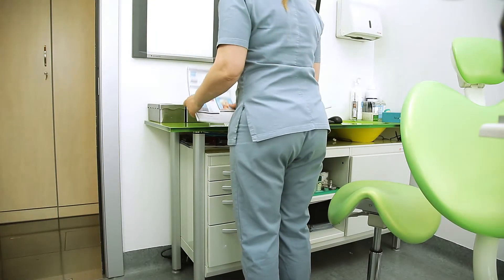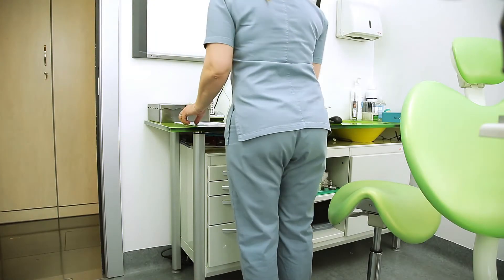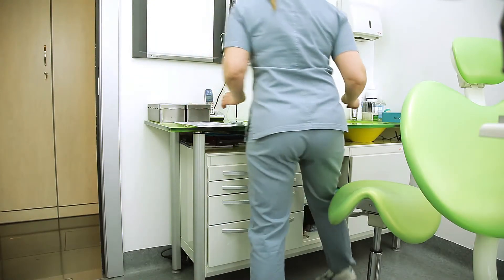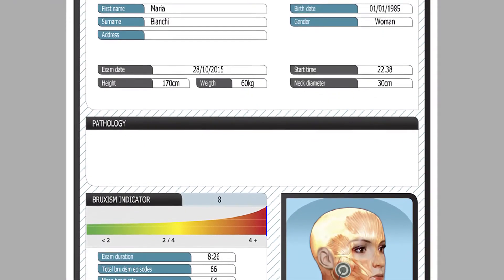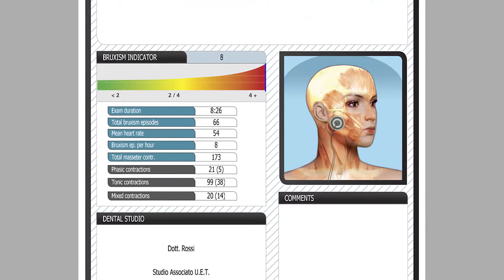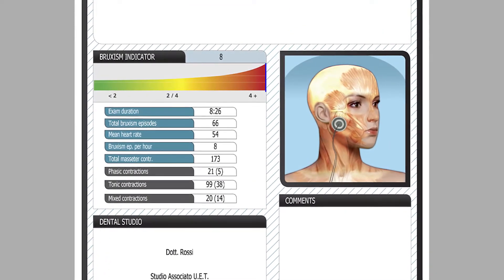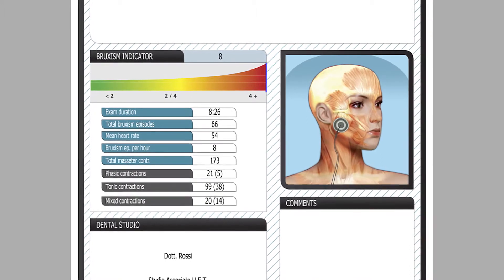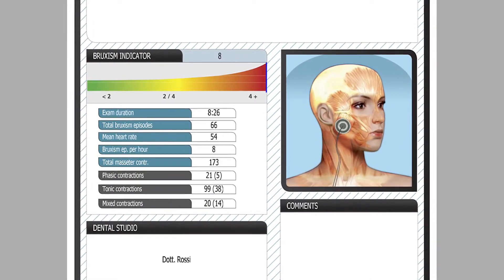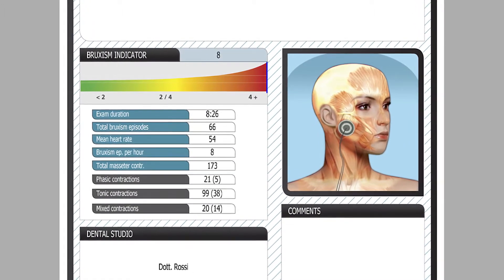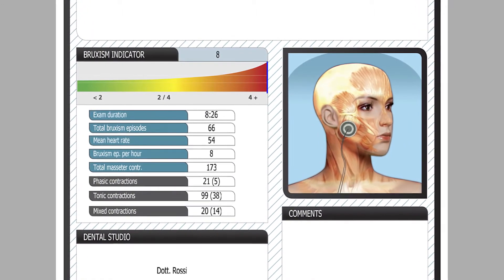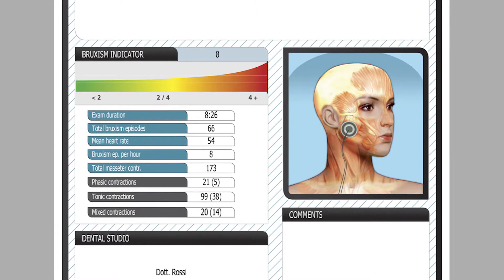The printout shows the patient's details, possible conditions, indices generated by the algorithm, and in particular, the bruxism index, which shows the average number of episodes per hour.